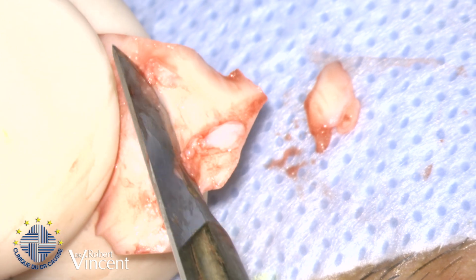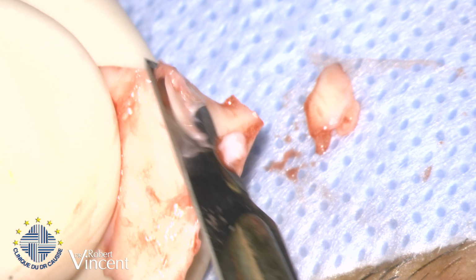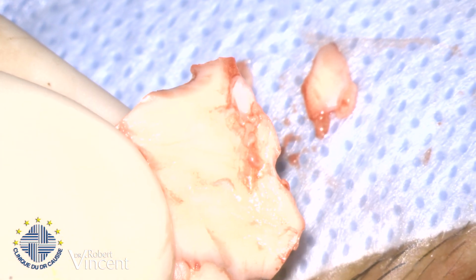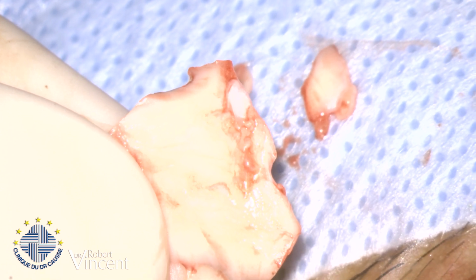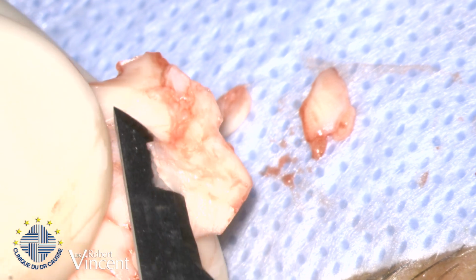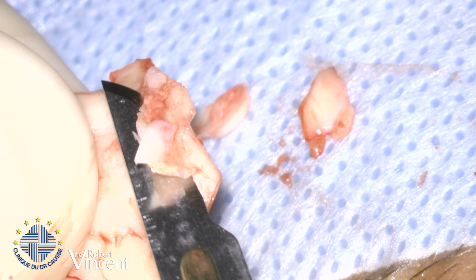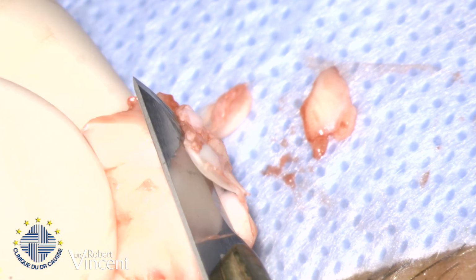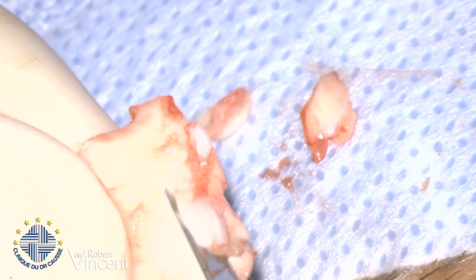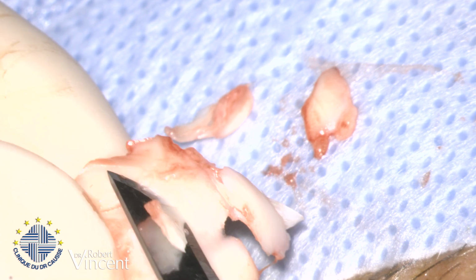Malleus prosthesis. Do you want to change the blade? Did you change it or not? No. It would be better because it's a bit dull. Good magnification in the microscope is very good. Yes. Try this. Well, it's good. The cartilage trimmer is fine too, I think. But I prefer to do it myself with this. You always leave the other part there. Yes.